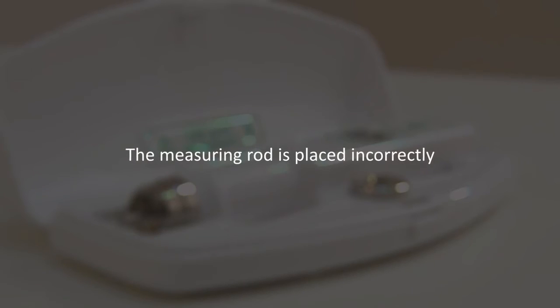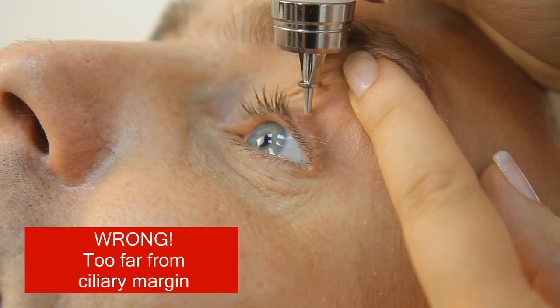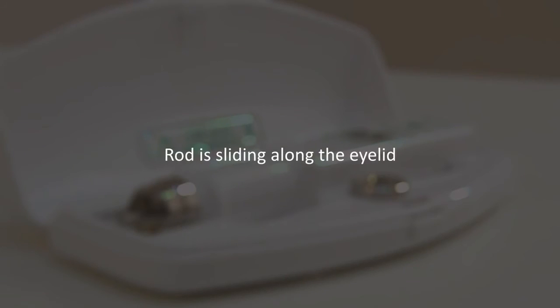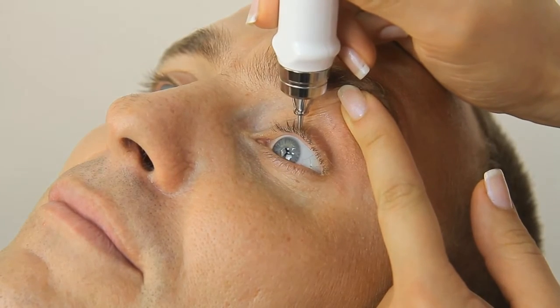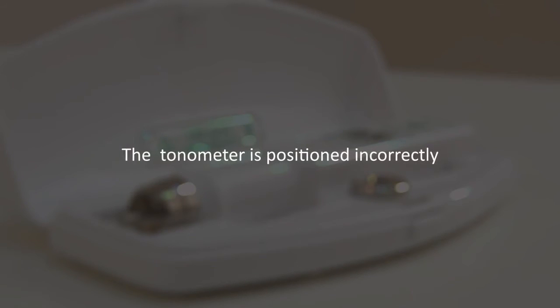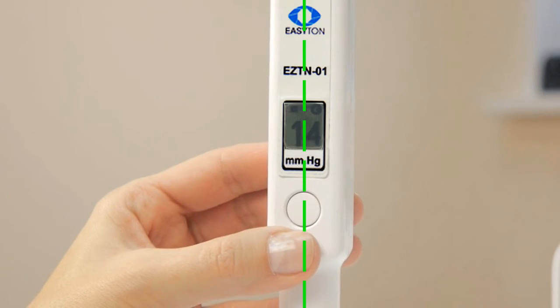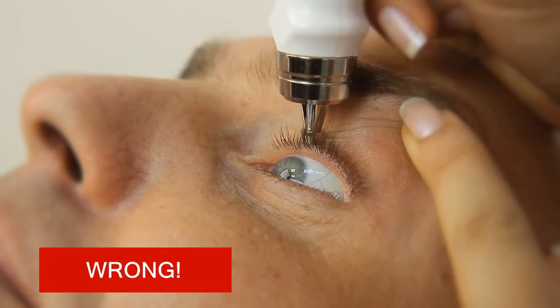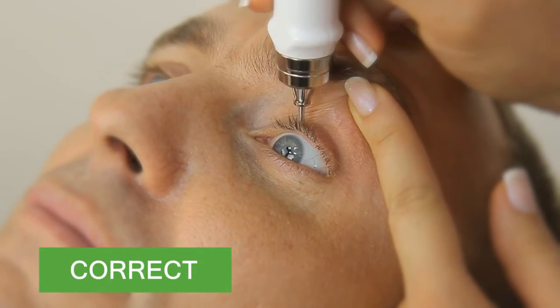The measuring rod is placed incorrectly. The tonometer rod should not be too close to the ciliary margin or too far apart from it. The rod must not slide along the eyelid during measurement; the tip of the rod should be fixed and must move only up or down. The tonometer is positioned incorrectly if the body deviates from vertical position — measuring is only done when the tonometer is placed upright. If the tonometer is lowered too far down, the protective ring touches the eyelid; it should be placed 2 to 3 millimeters above the eyelid surface.